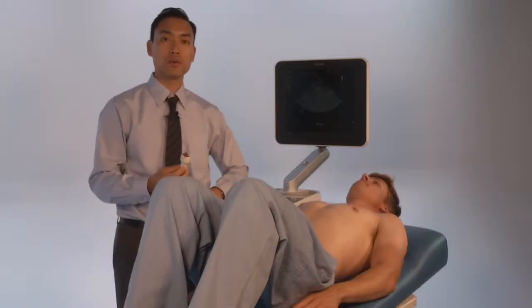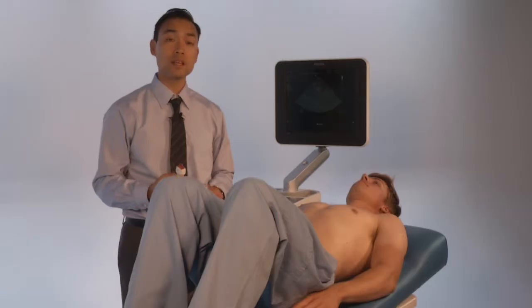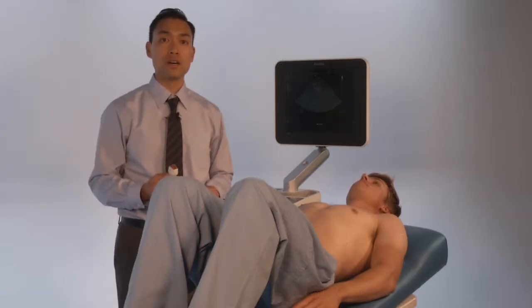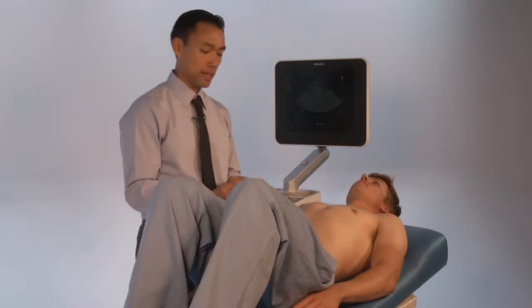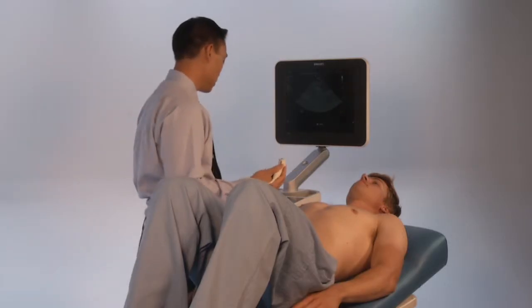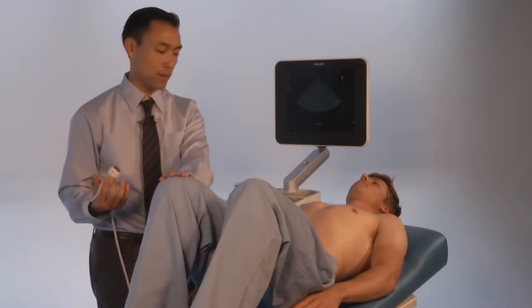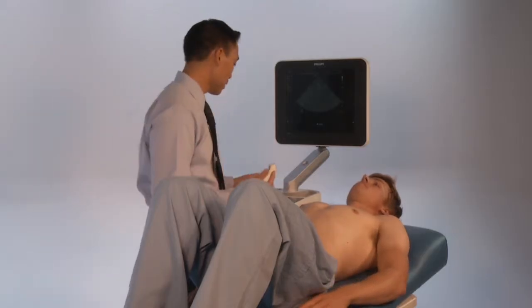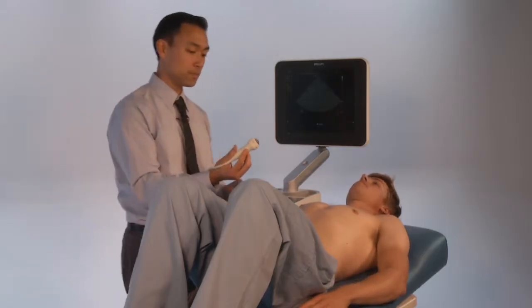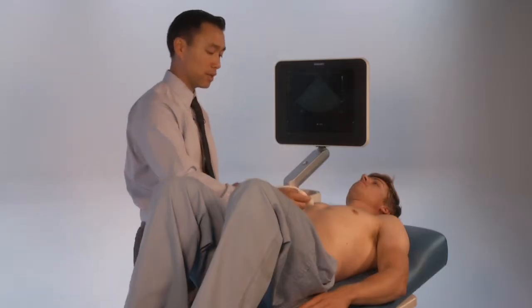We're gonna examine the abdominal vasculature now — the IVC — and how to assess for fluid status as well as central venous pressure. In order to do this scan, you want the patient supine; if you can bend their legs, great, to relax the abdominal musculature. You're gonna use a phased array probe on abdominal settings.